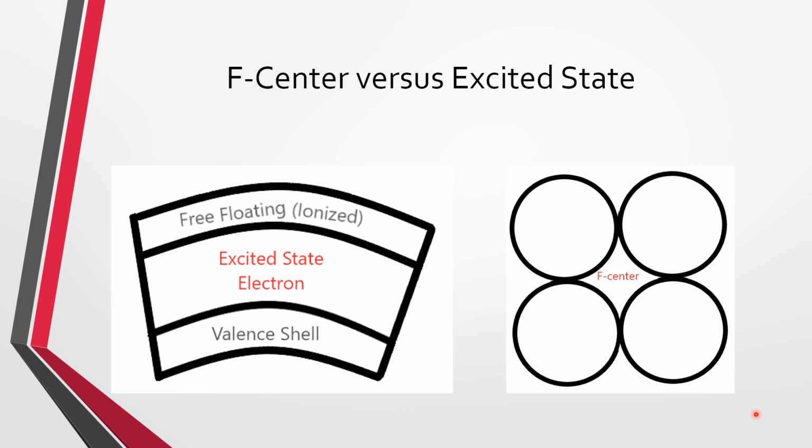With europium as a doping agent and barium fluorohalide, there is an F center, which is a hole, as we talked about, that the electron can be excited and enter into, and still be in the atom's influence. So we see here this is looking at the same exact thing. It's just two different concepts of physics, I guess, but it's actually the same thing.